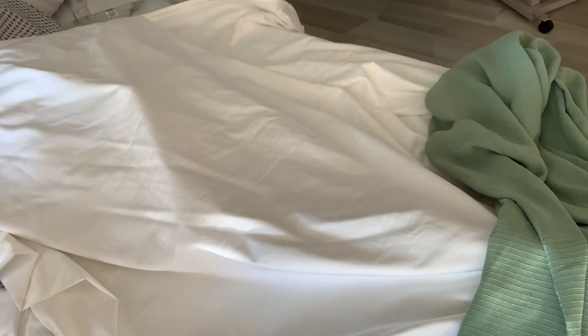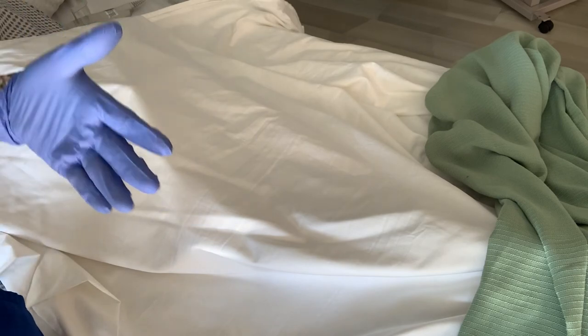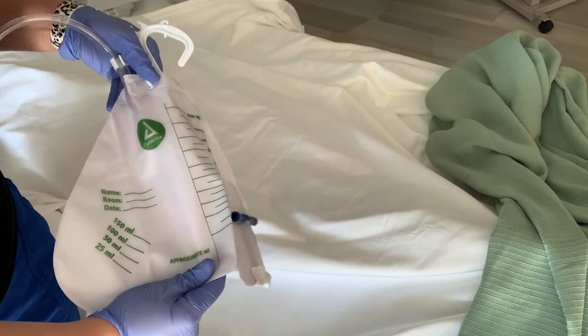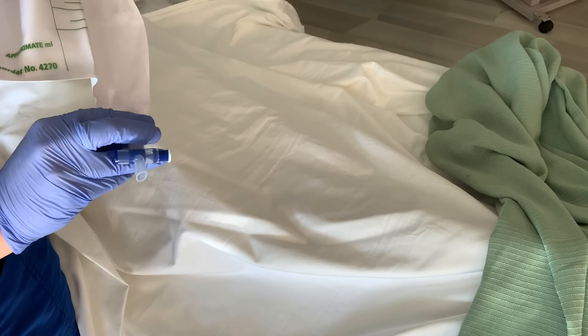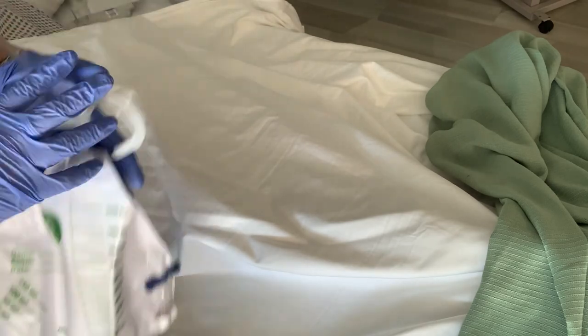Now we're going to remove the Foley catheter — this part of the procedure is the same for both male and female. Step one: assist our patient to a dorsal recumbent position, make sure we have gloves on — they do not have to be sterile, just regular gloves. Let them know what we're doing and drape them with the sheet. Don't expose any area aside from the perineal area. Assist the female to flex her legs; assist the male to spread his legs apart. The very first thing before we remove any Foley catheter is go down to where the catheter bag is draining and empty it — these pieces come undone and you hold them over a graduated cylinder to drain it. Make sure this bag is empty before you remove the Foley catheter.